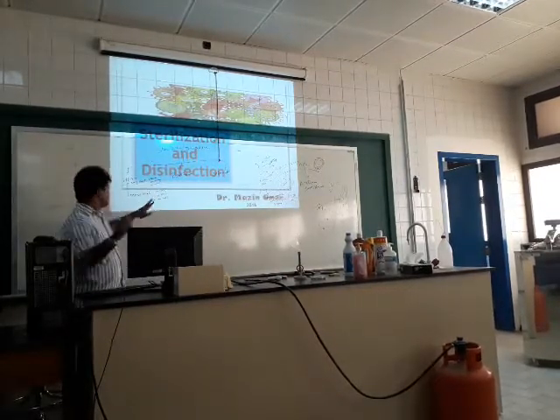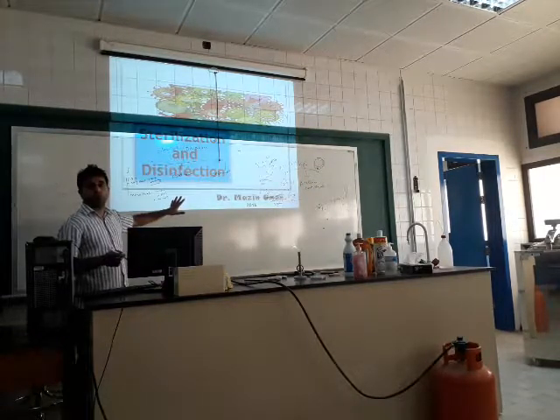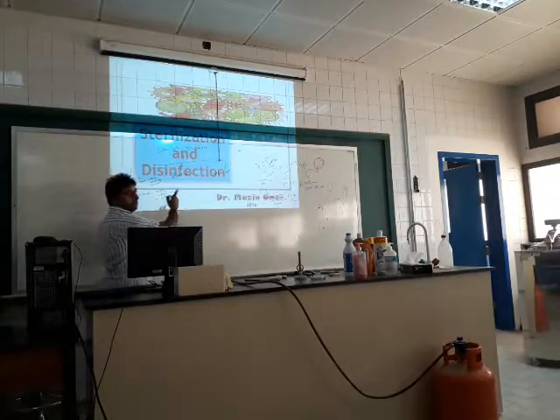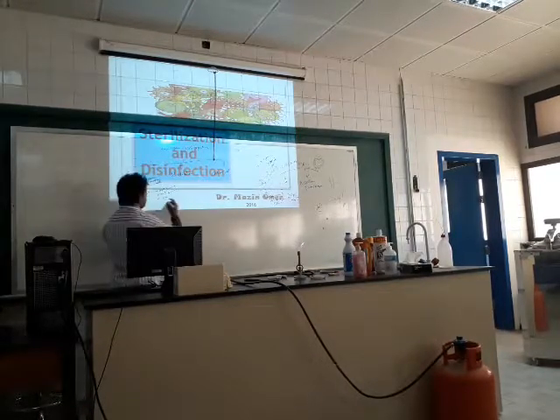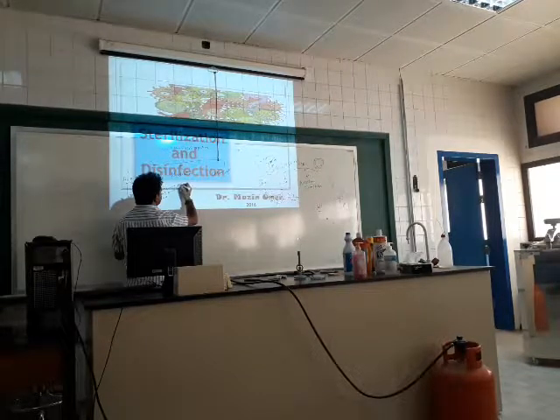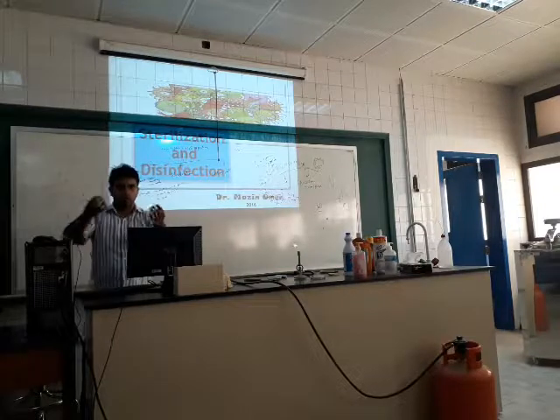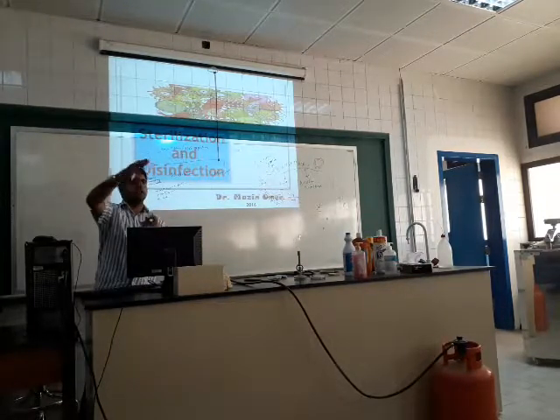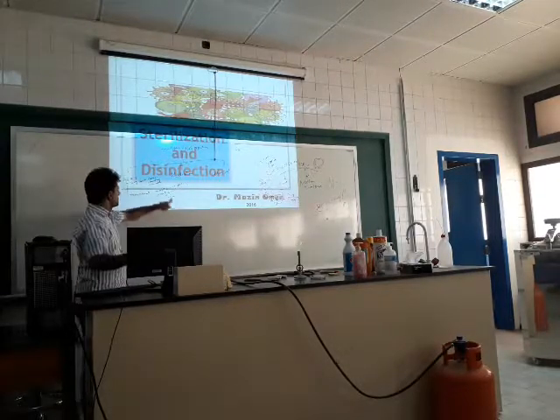This is again a method of dry heat. Now in moist heat, three types of temperature are used: you kill the microbes at 100 degrees Celsius, at greater than 100, or at less than 100. At 100 it is direct boiling. If you put water at home, after 10 minutes it starts boiling, and when it reaches 100 degrees you get rid of the microbes, but not the spores.